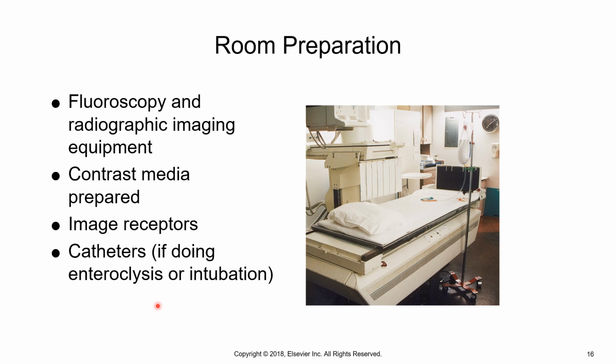Actually, on page 511 is where that patient prep is. About halfway down on the left column, it says the patient prep for a small bowel is identical to an upper GI. The most common study consists of a combination of two of those: one long exam looking at the upper GI and then the small bowel. The goal is always an empty stomach.